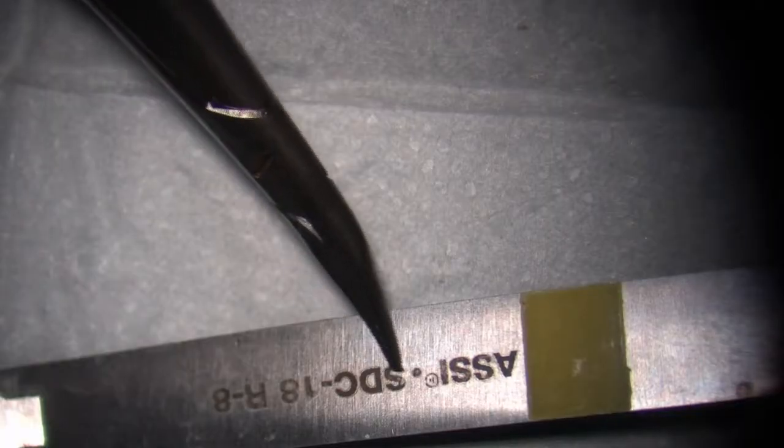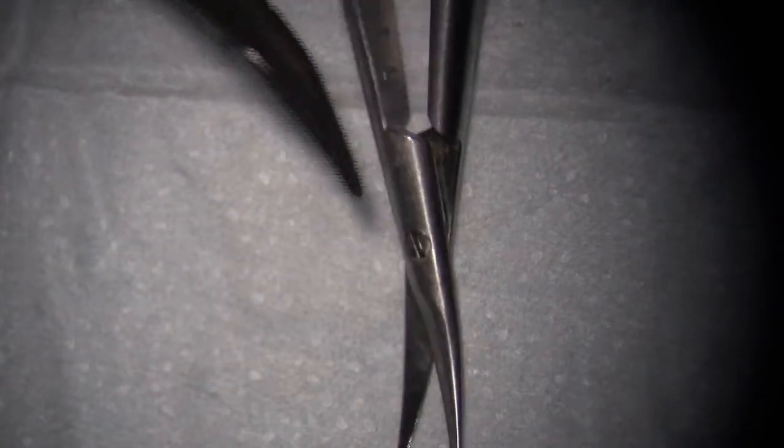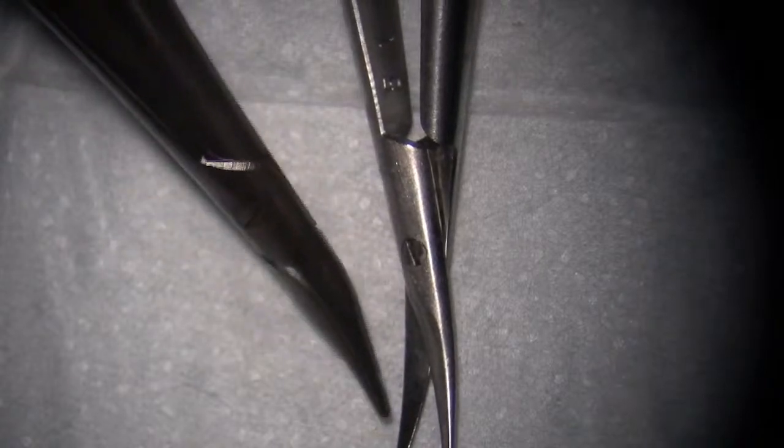This S is scissor. This D is dissection. This C is curve. So the curved scissor is a dissection scissor. You can see most of them, even the regular scissor, we use the curved scissor to dissect something out instead of a straight scissor. Straight scissor, most of the time we want to make a straight cut, a suture or something.